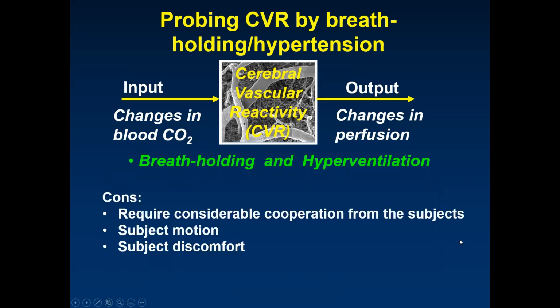But the breath holding or hyperventilation also requires considerable cooperation from the subjects. And so it may not be suitable for elderly patients or patients that cannot perform these tasks, such as patients who are very sick. And also these methods are subject to motion and can lead to subject discomfort.